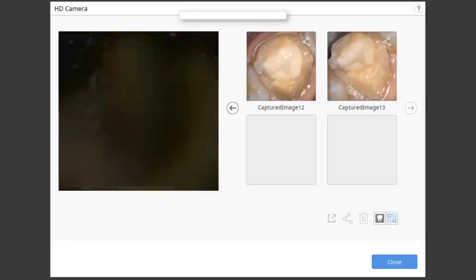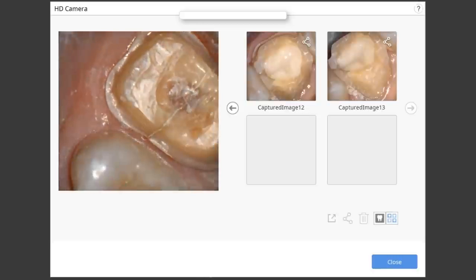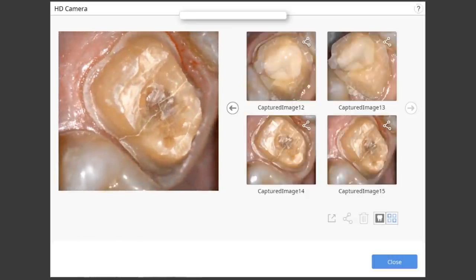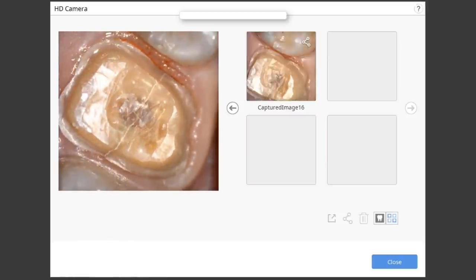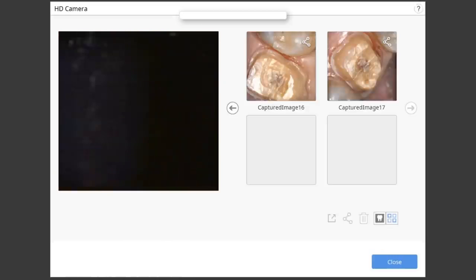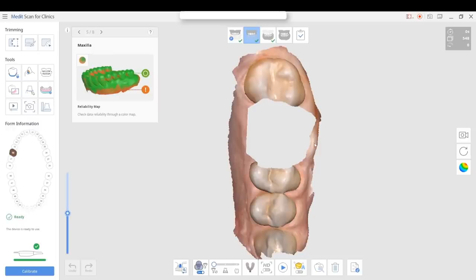So next we'll reduce the facial walls, the interproximal, and then ultimately now we've got almost the final prep here. You can clearly see the crack line that extends from the mesial to the distal, right across the occlusal surface. Now, the clinical decision was made to actually place a restoration on this tooth and give it a fighting chance and see how the patient responds.